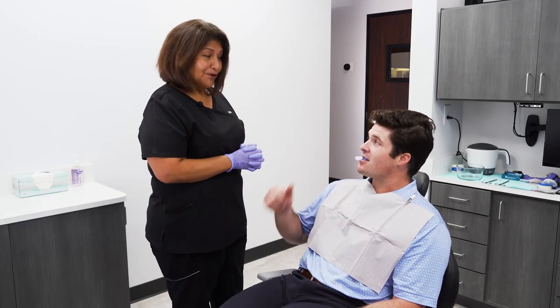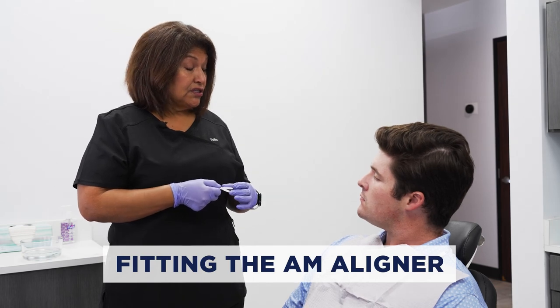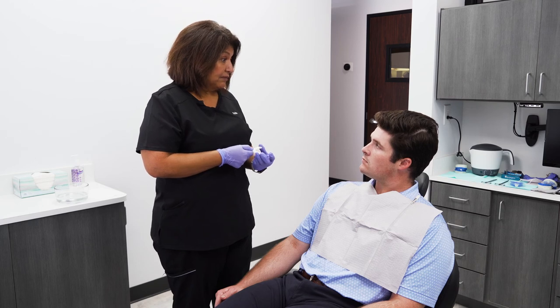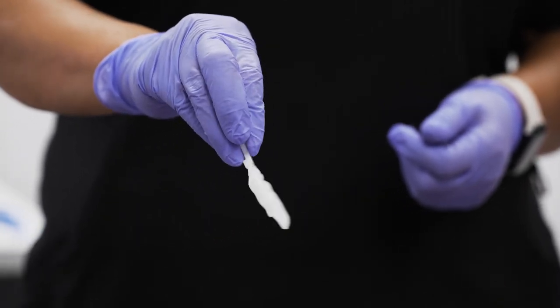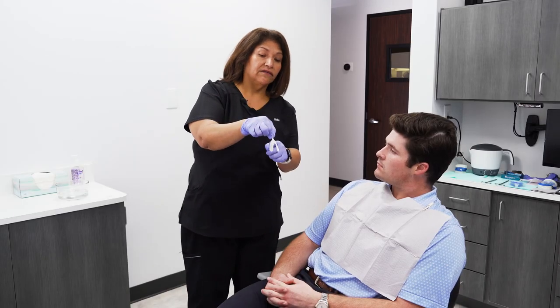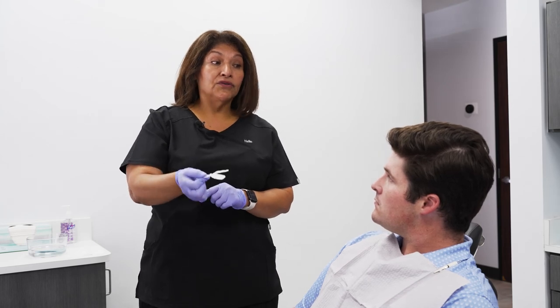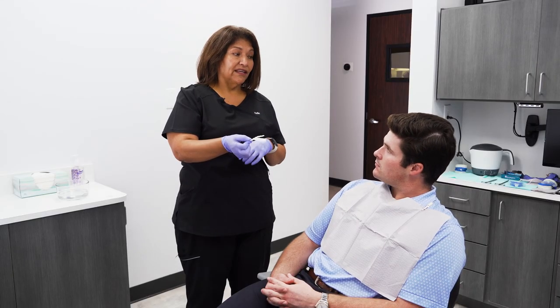Does that feel okay to you? Perfect. Okay, you're going to take it out. We're going to be fitting you now to your morning repositioner that also comes with the kit. It's very important — we call it the AM aligner. Make sure that you use this at least for two minutes every morning, and this will help reset the bite as well as the jaw. This is what the AM aligner will look like after it's heated through and captured the bite. You can see through Garrison how your teeth fit in there. It's very important that you use this aligner every morning for at least two minutes. Bite into it, squeeze, and that's going to help everything get back into alignment.